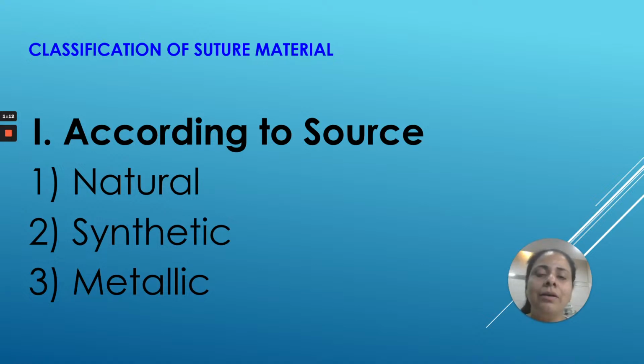And secondly, a little bit of theory is really required even when you are working in totally practical scenarios, because unless you know what kind of material it is and what its different properties are, how can you use it effectively in the oral cavity? So if you find it a little boring, you can skip the video, but I would suggest you go through it at least once, so that you know what kind of materials are preferred in the oral cavity and why. So let's jump on to the classification of suture material.